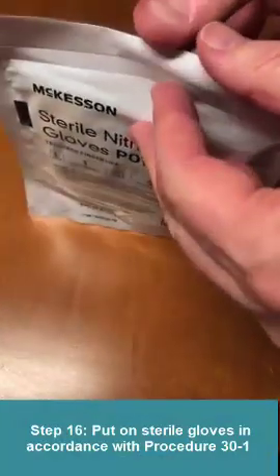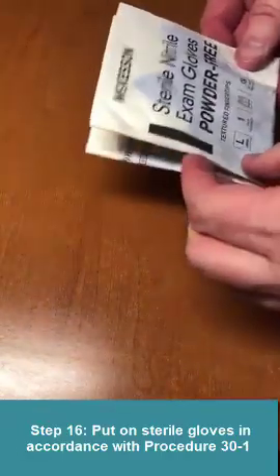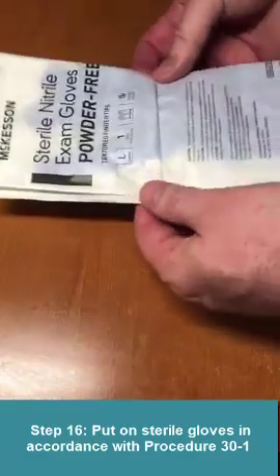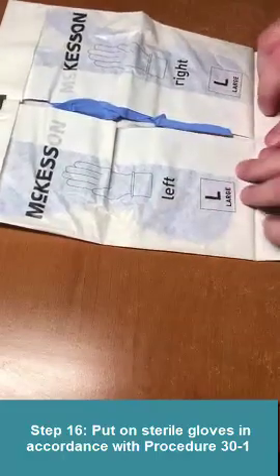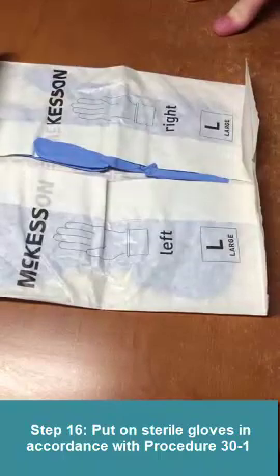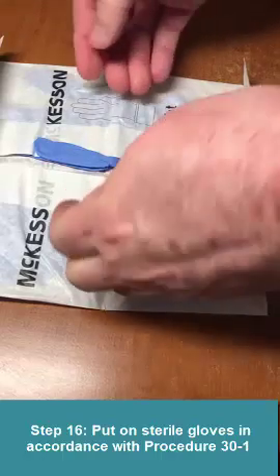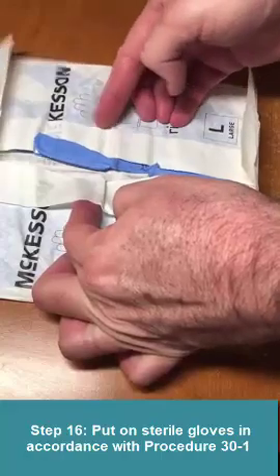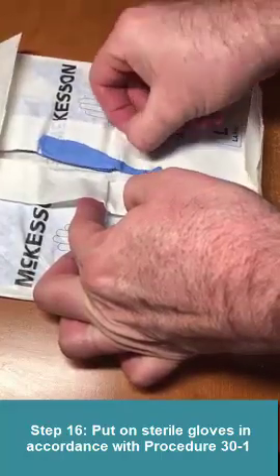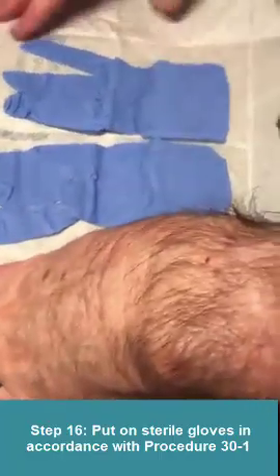So continuing, I'm going to put on my sterile gloves. I'm going to open the package by peeling it back from the top, removing the inside paper package, folding it out. And I'm going to put the right hand, the dominant hand, on first using the non-dominant or left hand. I'm going to open this package without touching anything but the cuff itself here, to expose the gloves.